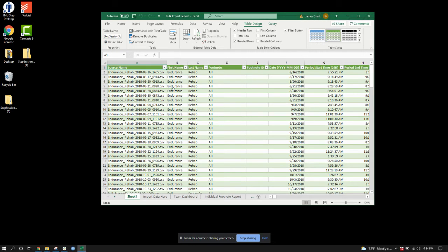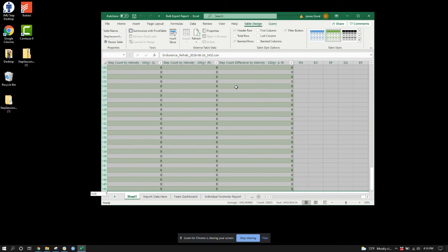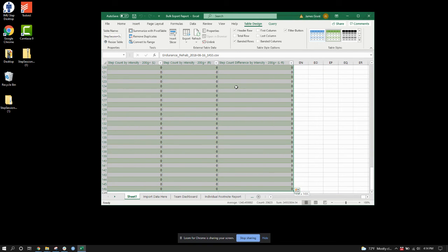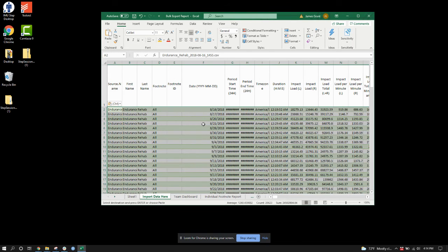On the bulk export report, it has your import data section here. So I'm going to select everything that's been put into the CSV file, except for the headers, copy it, and then paste it into my import data section here.